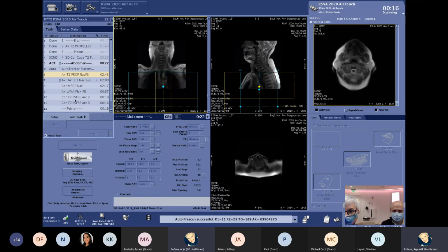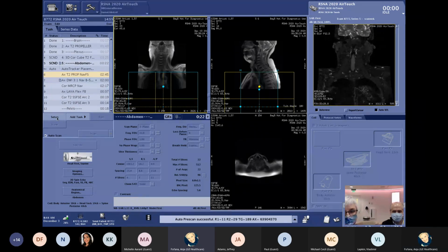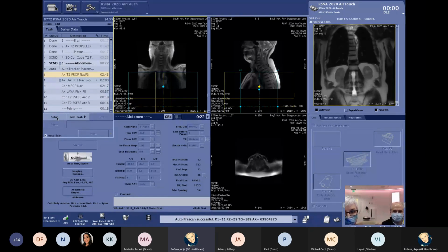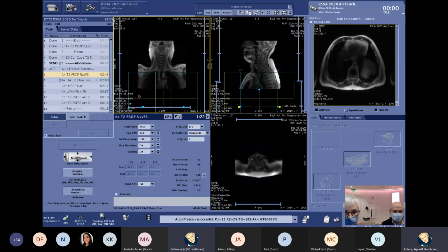Okay, localizer is running. And again, it happened that the scanner will do the sensitivity map to really understand where now the air coil is on the patient, so that we don't have to worry about thinking now, for example, deselecting the head coil or things. We don't have to think about it. The system will do that for us. So now I can go ahead and set up the sequence.